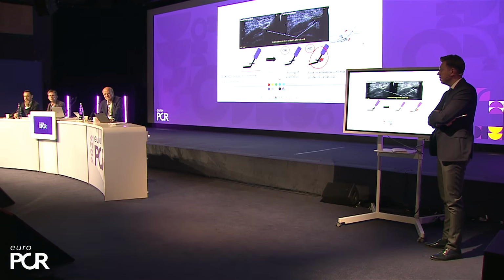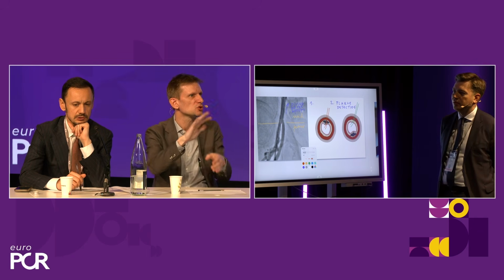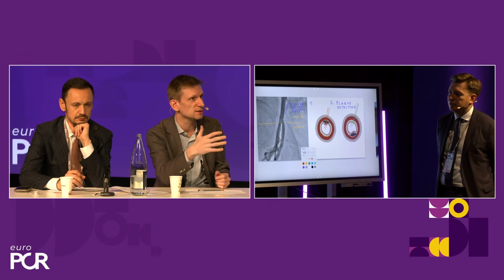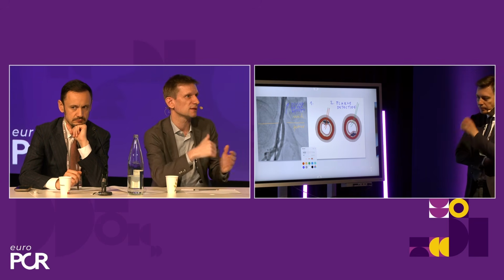On echo, yes, but on fluoroscopy, no. On fluoro, it's this. On the other hand, if you look in detail at your CT, that's what I do: I turn on my CT and look where my artery dives, and very often, in the majority of classical TAVI patients, it is at the top of the femoral head. So it's a good thing. You don't want to puncture higher than that anyway, because if you have a complication there, you also risk retroperitoneal bleed and all that kind of complication. But I do actively look at it on my CT.